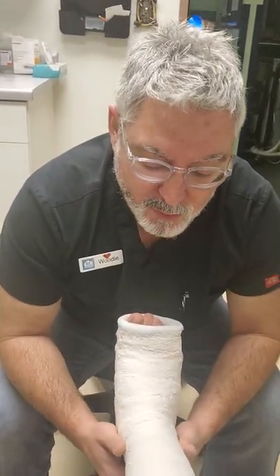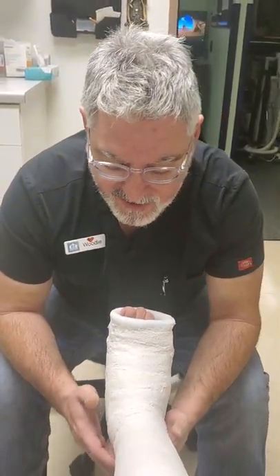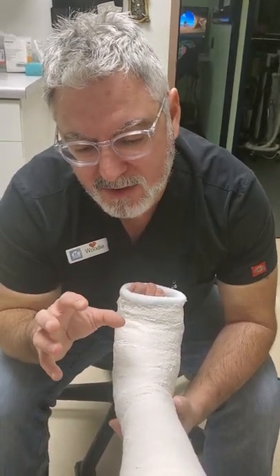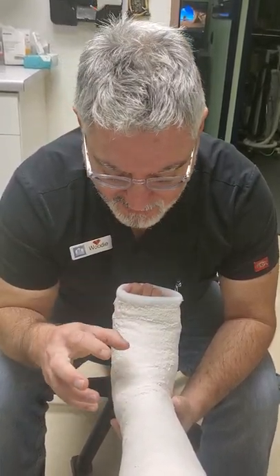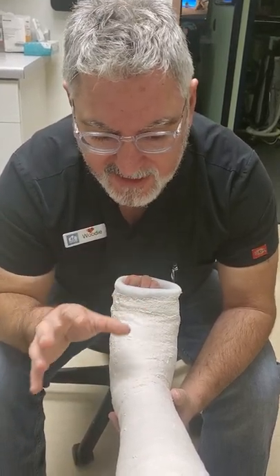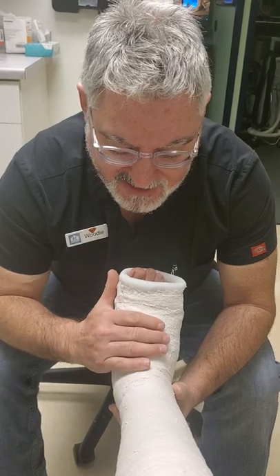Hey everybody, welcome back. Real quick, we're going to do a short video on removing a regular size plaster short leg cast. We're going to use a cast saw to do that, but before we get into the cast saw, I want to talk a little bit about plaster versus fiberglass cast removal.